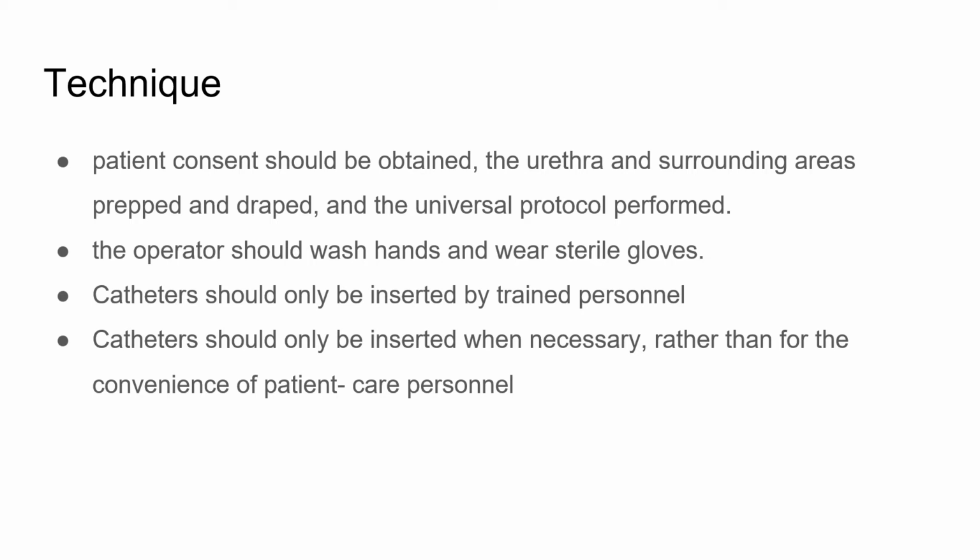The operator, or one who does the procedure, should wash his hands and wear a sterile glove. So this has to be done in a sterile glove. Catheter should only be inserted by a trained person. This is according to the guidelines, wherein trained personnel should do this.